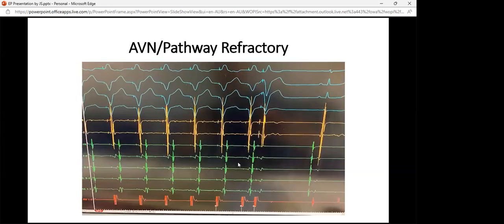So the next thing I did is we kept pacing. And the third thing we look at is CS activation. So again, we pace the ventricle. We've got one-to-one conduction. And hopefully you can see it here, trust me otherwise, that when I pace the ventricle, the first signal I see in the atrium is CS distal, the CS 1-2 catheter.